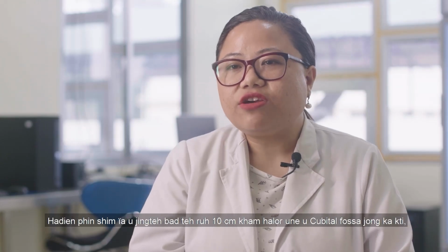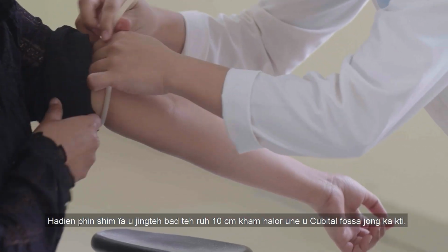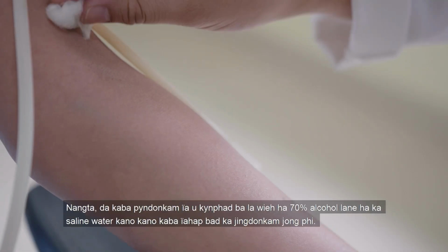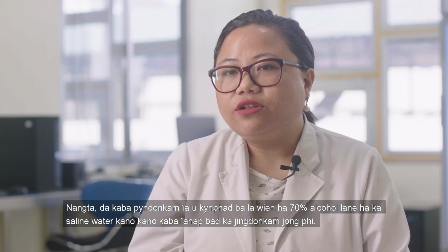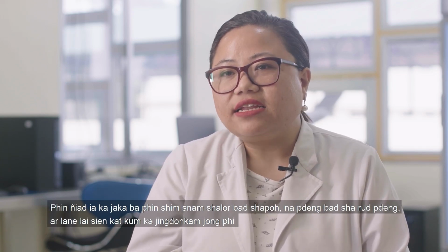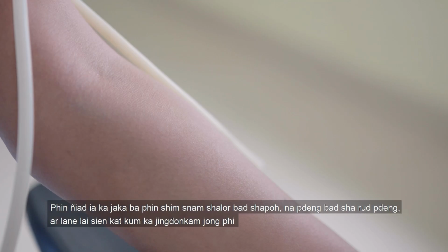Next, you're going to take your tourniquet and apply it at least 10 centimeters above the cubital fossa of the arm, with just enough pressure so that it doesn't cause pain to the patient. Next, with the help of cotton that's soaked in 70% alcohol or in normal saline, whichever is feasible in your setup, you're going to rub the area with it in an inward to outward fashion, 2 or 3 times depending on the need.